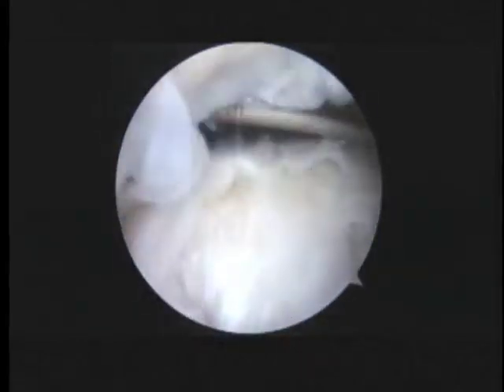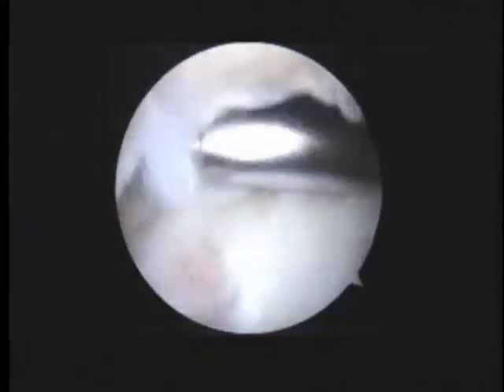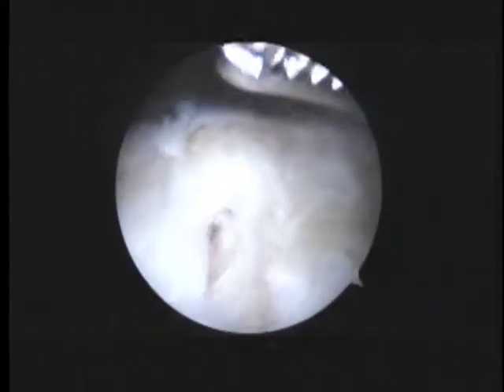So we'll go off on the video for just a little bit here. Okay, so we've already taken off a little bit of bone, and this is the tear in the rotator cuff. It's more of a bursal-sided tear. We'll show you here as we remove a little bit of the synovial tissue. So here's the bursal-sided tear here.